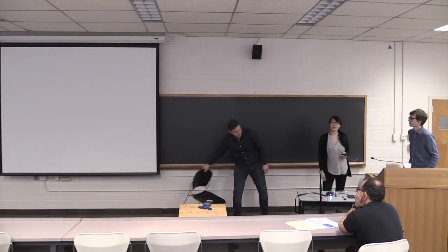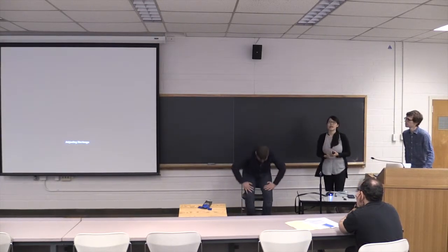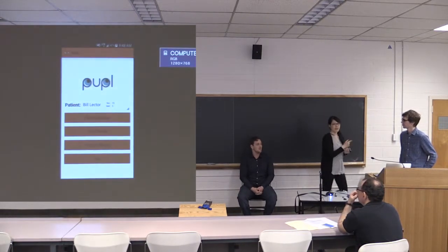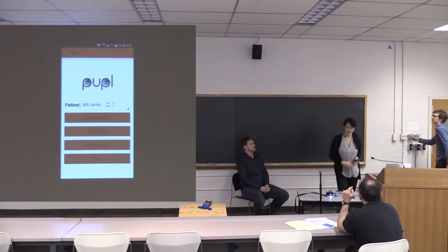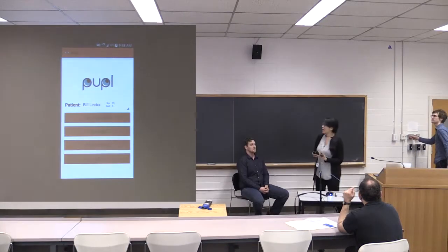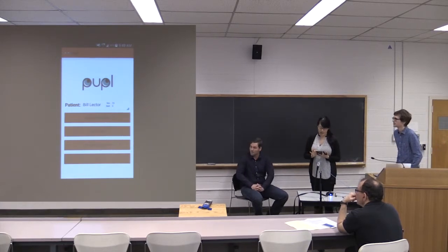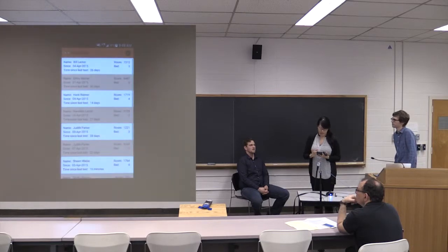Yes. So in our demo, Sean is going to be our patient, and myself and Clyde are going to be the nurses. You can actually face me. Okay, so in the app, can you guys see the app okay? Okay, so I'm going to go into the patient manager. We're not working with Bill today, so I'm going to look for Sean.